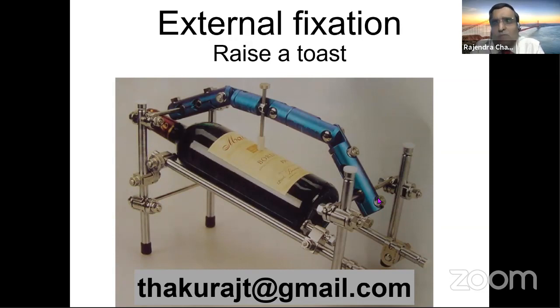However, most of the time the pins are away from the actual fracture zone or the raw area. And then you can seal the border. Even if you have 1 inch of border, that is good enough to seal.